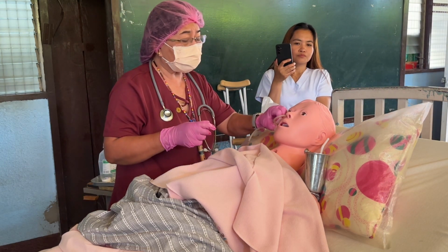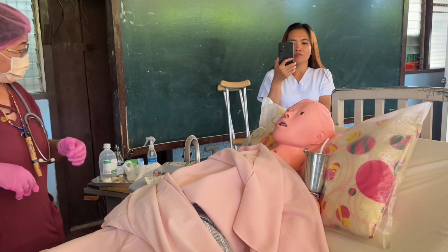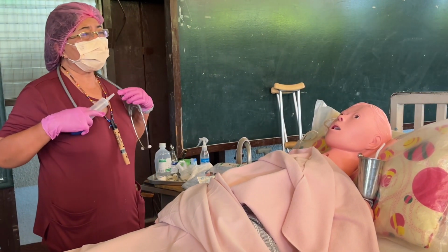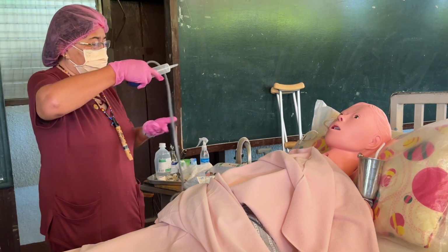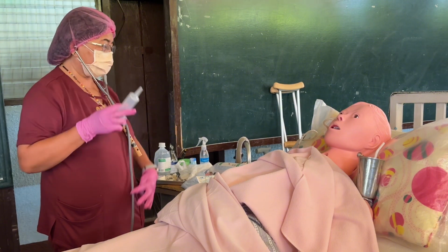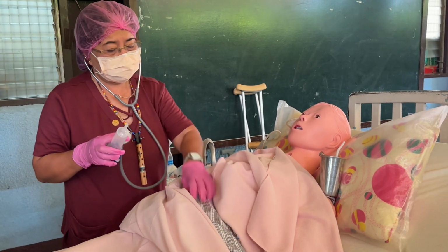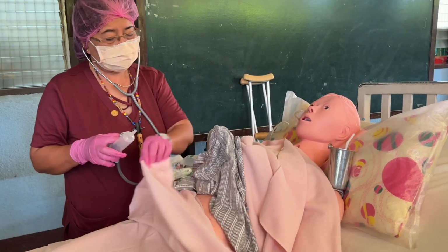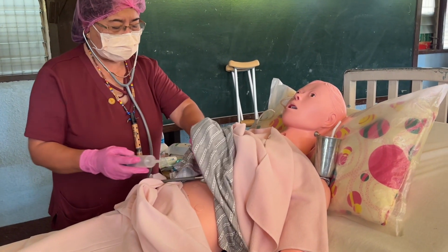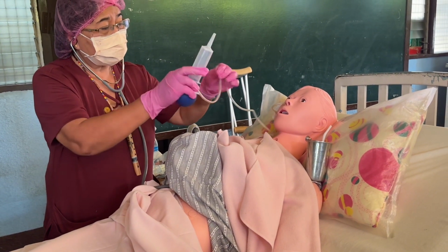Then I'm now going to confirm 5 ways. One is the introduction of air using the aseptic syringe, and you listen using the stethoscope for borborygmi sound or whooshing sound. Okay, stethoscope. Okay, put the diaphragm at the epigastric area. Open. Okay. Get the tube. Open, but kink it. Kink.